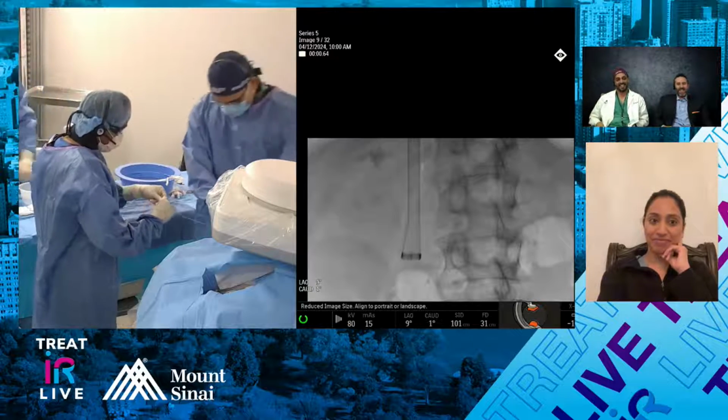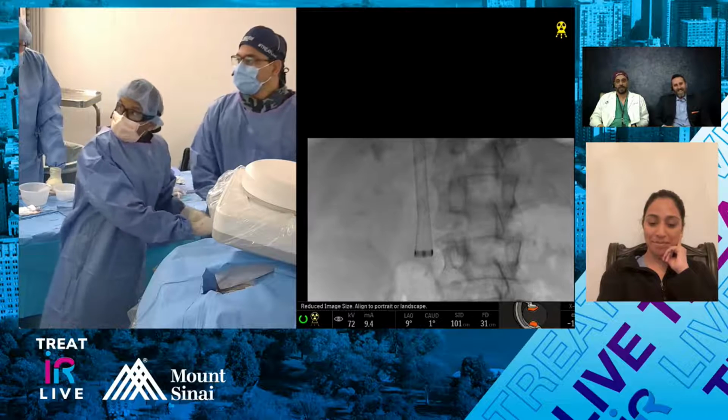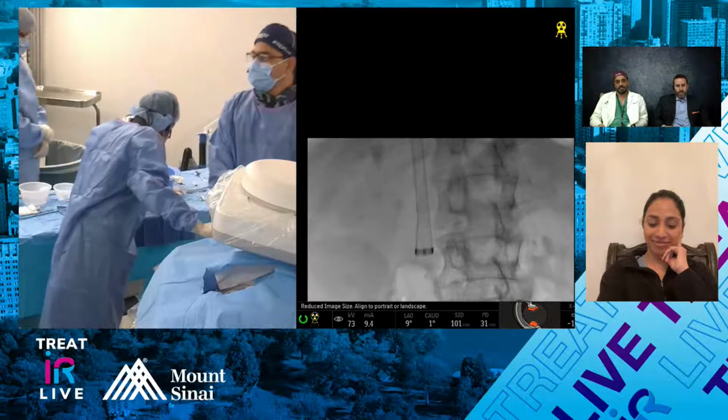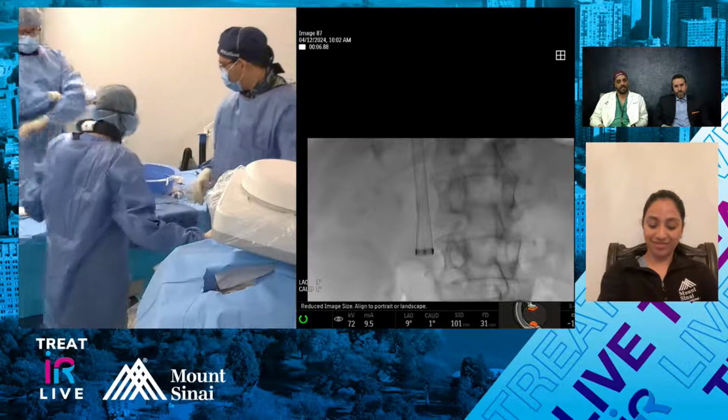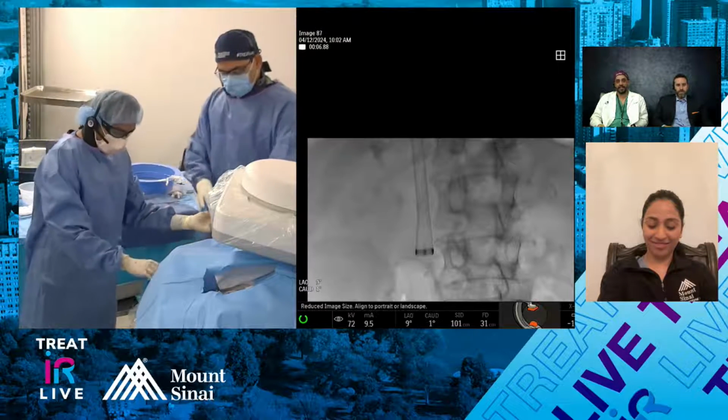Yeah, exactly. Feeling great. So I always get a single shot or an X-ray of the chest just to make sure there are no legs already there, and then do it at the end just to make sure all the legs are there. Count the legs, kind of thing, because I don't want to get blamed for broken legs if it was there before I got there.